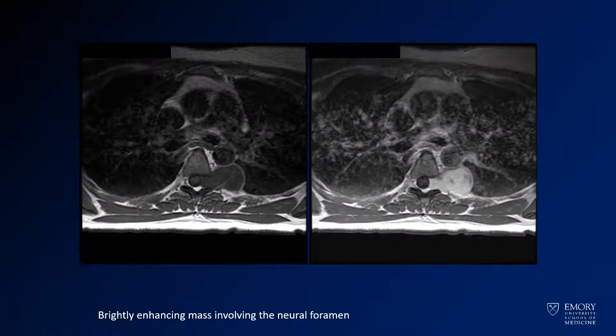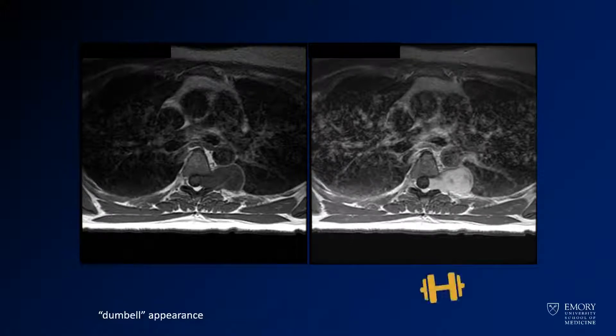Here you see the MR images of pre- and post-contrast. You have this brightly enhancing lesion. This kind of has a dumbbell shape with that waist at the level of the neural foramen.